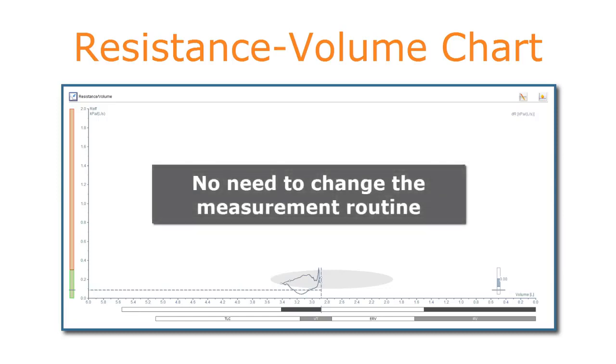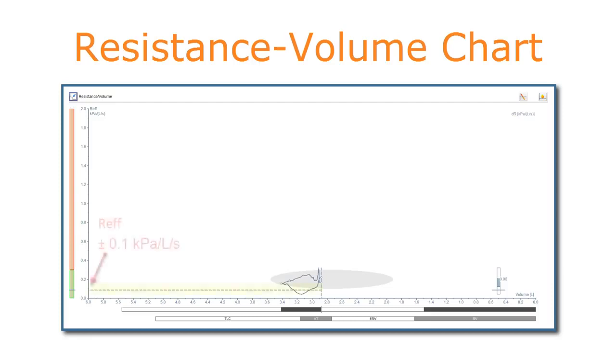There is no need to change your measurement routine. The resistance-volume chart is automatically created after the body measurement. A horizontal dashed line displays the effective airway resistance. The vertical dashed line displays the breathing level at which the measurement has been performed. For quick orientation, the predicted area of the resistance-volume loop is shown in the chart.